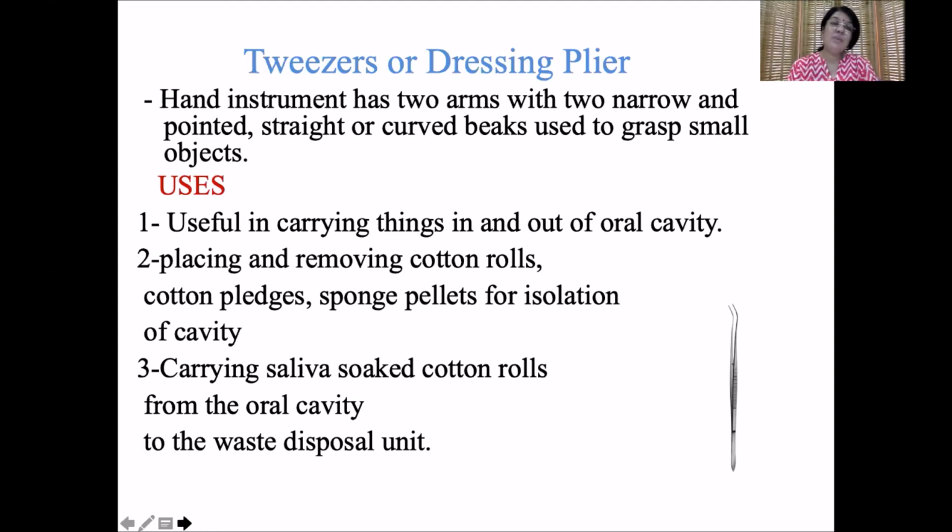Till now, you haven't worked in a patient's mouth. So you don't realize that the patient's mouth is full of saliva. This saliva will keep entering into the area where you are working. So you need to isolate that area and make it saliva free. Saliva doesn't come out of a tap so that you can just close the tap and there is no saliva in the mouth. It doesn't happen like this.